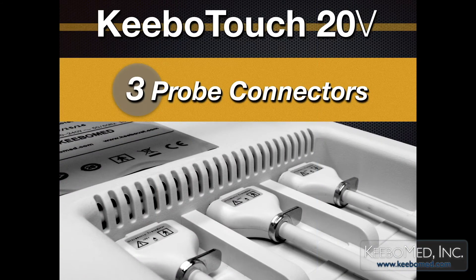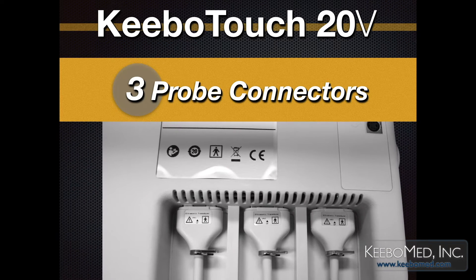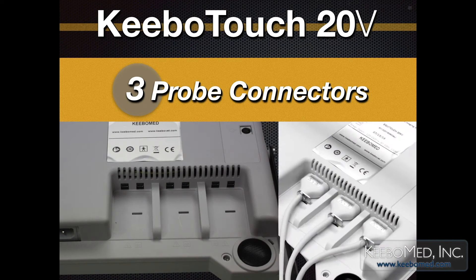Kibo Touch 20V features 3 probe connectors. It is the only machine on the market that allows you to connect 3 probes at the same time.